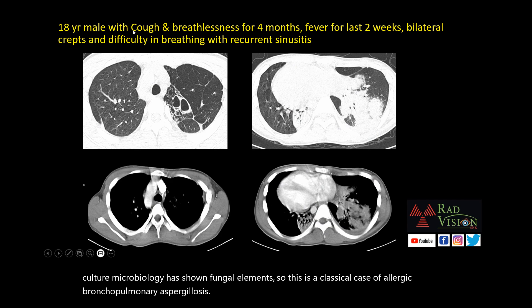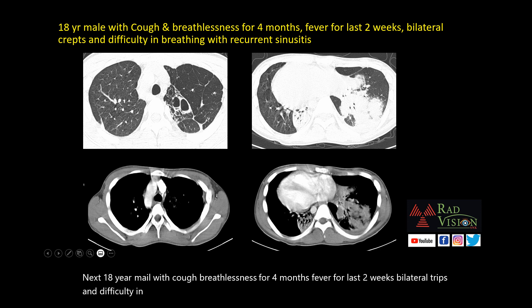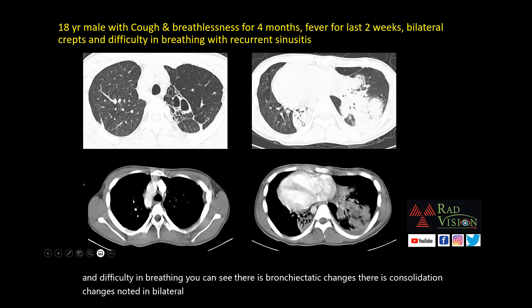Next case: An 18-year-old male with cough, breathlessness for 4 months, fever for the last 2 weeks, bilateral crepitations, and difficulty in breathing. You can see there are bronchiectatic changes. There is consolidation noted in bilateral lower lobes with air bronchograms.